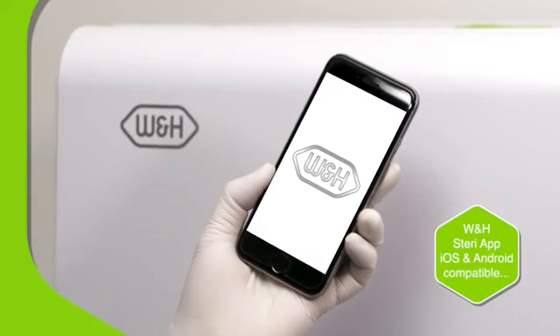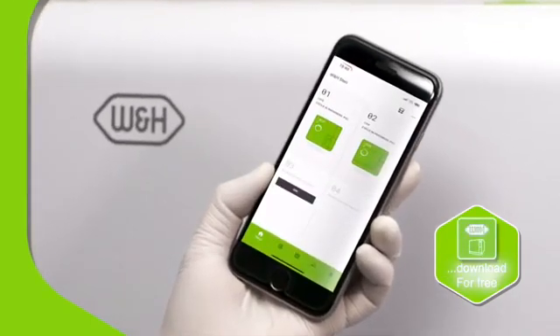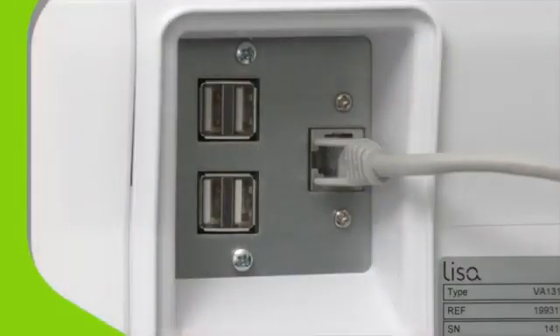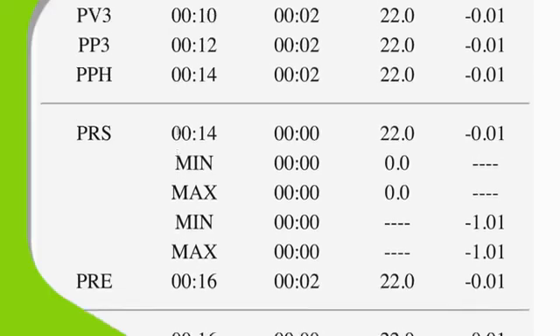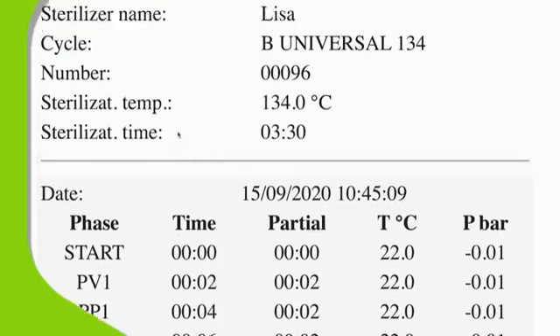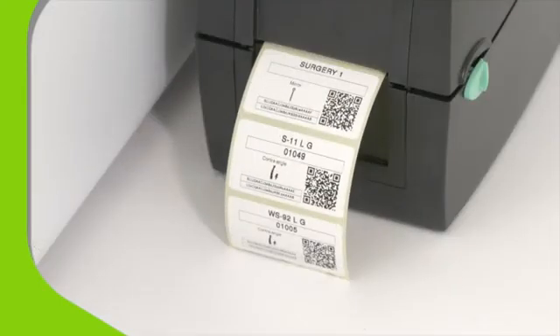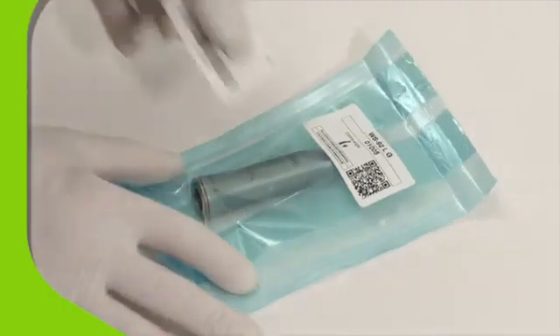With the W&H Steri app, you can remotely monitor up to four Lisa sterilizers at once, either using a tethered LAN connection or our optional Wi-Fi kit. The remote data storage function makes record keeping effortless. Optional extras like the LisaSafe label printer and QR scanner allow you to make full use of the unique Elitrace system for complete peace of mind.